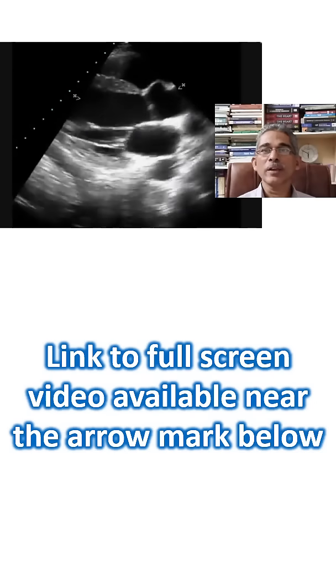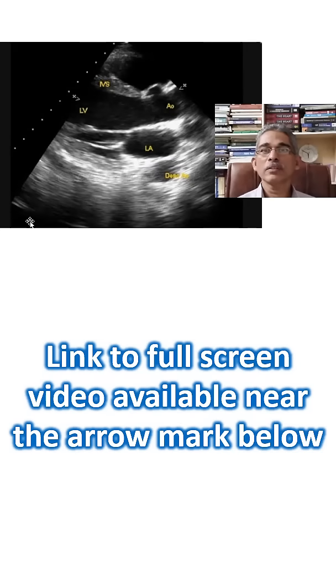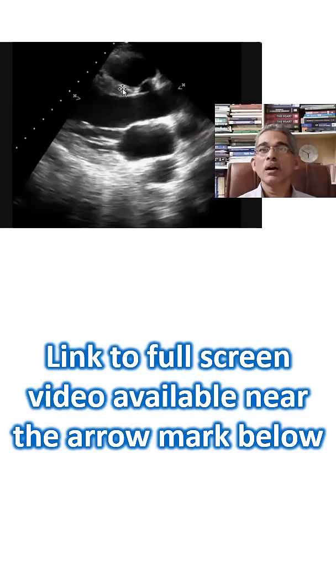You can see it moving now. This is the interventricular septum, and I will freeze that view for you. This is the interventricular septum, right ventricular outflow tract, and anterior surface of the right ventricle.